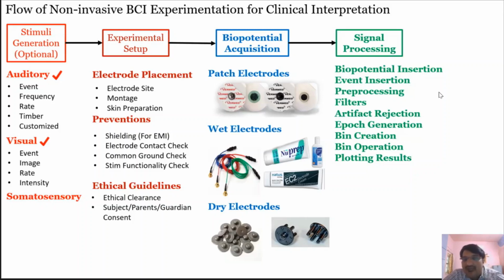Getting those 100 different time intervals from the obtained run of EEG is your epoch generation. If the same stimulus is presented 100 times and one stimulus time interval is 1 second, then your entire experiment lasts 100 seconds, and from the recording you are extracting 1 second 100 times. That is your epoch generation.